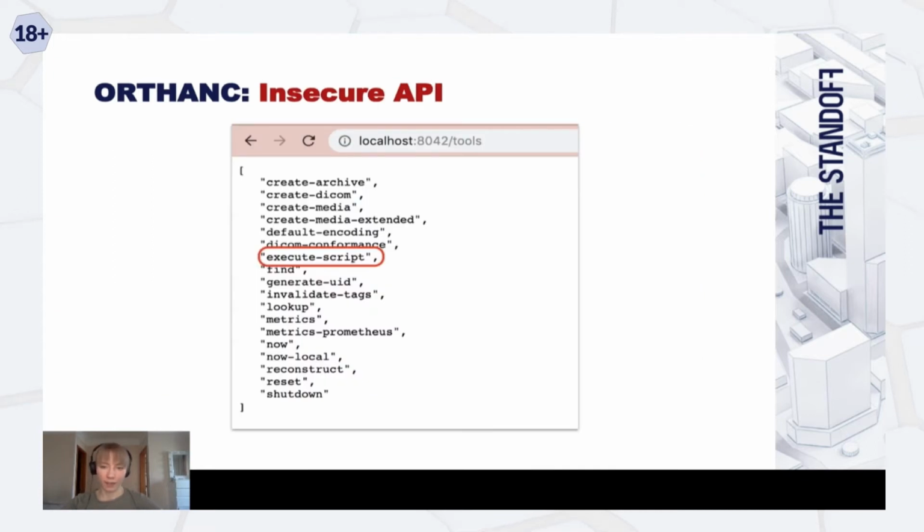Let's take a look at the API and the methods that are accessible. There are methods that work with the DICOM protocol, and there are some methods working with the server, like reset and shutdown, and a very attractive method. It's called execute script.